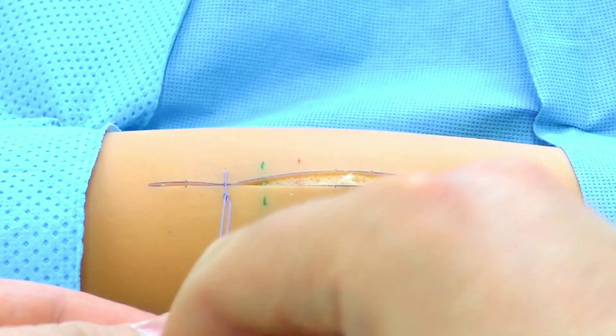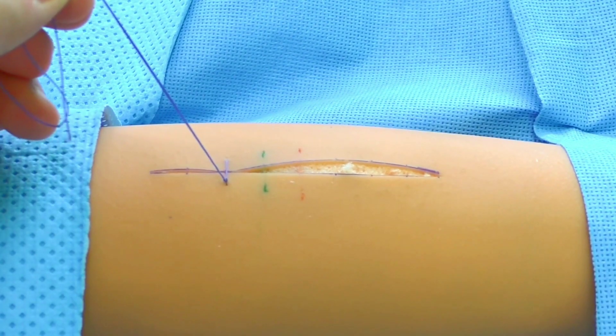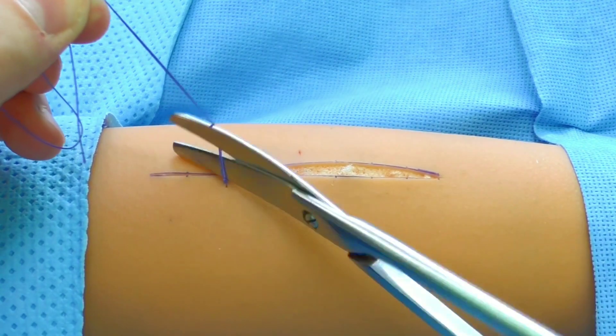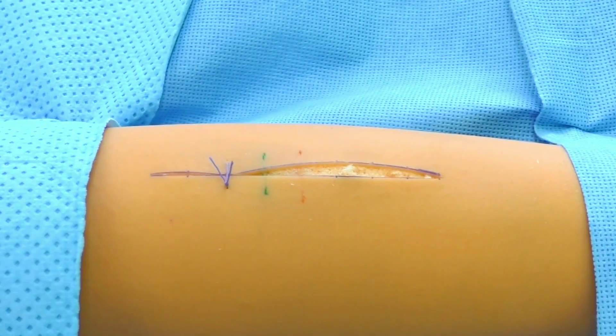The distance between the interrupted sutures is defined by the necessity of high-grade wound edge adaptation, and averages one centimeter.